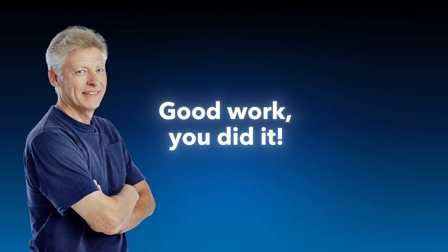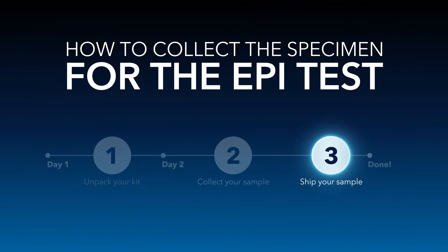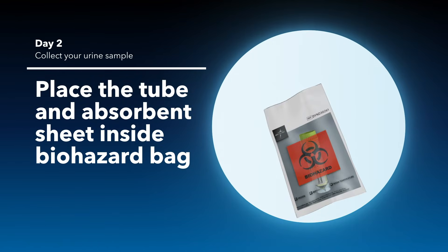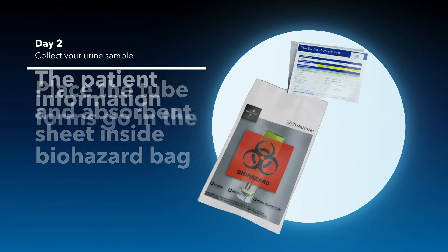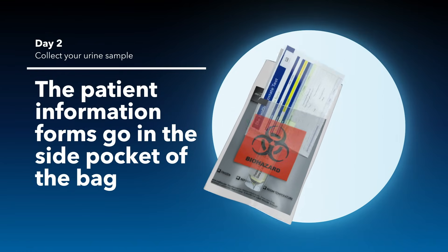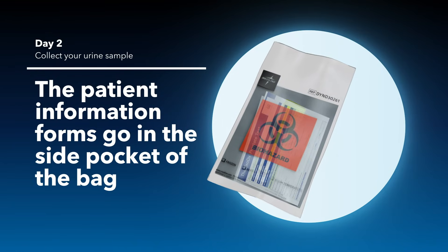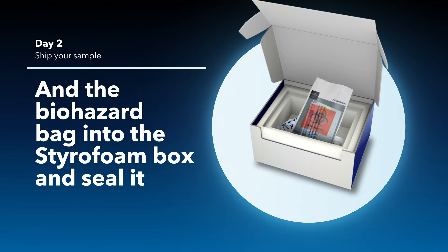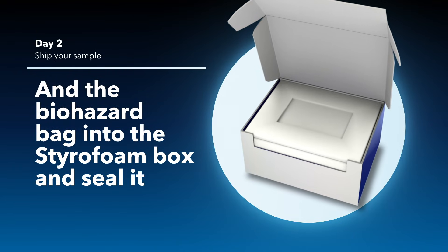Good work — you did it! Get ready to ship by placing the tube and the absorbent sheet inside the biohazard bag and seal the bag. The patient information forms go in the side pocket of the bag. Now place the frozen packs and the biohazard bag into the styrofoam box and seal the box.